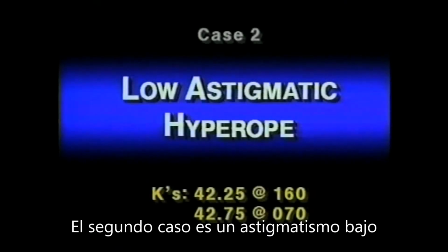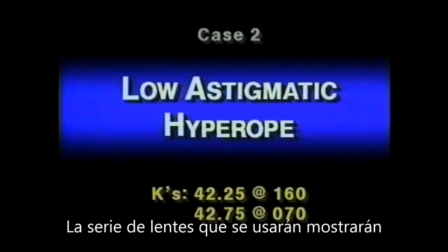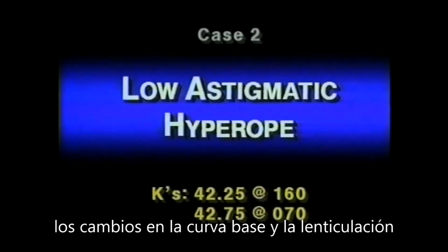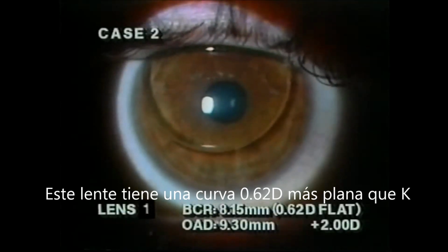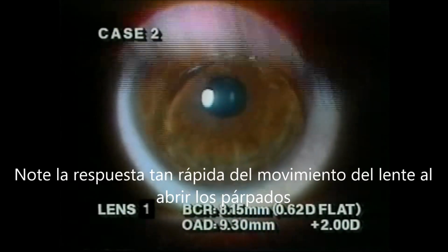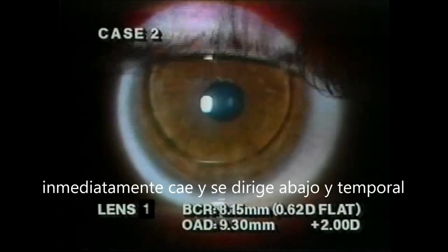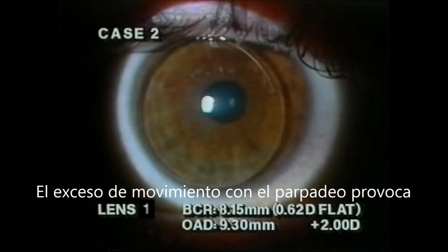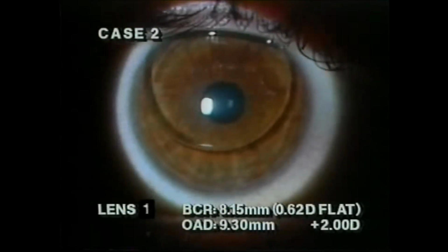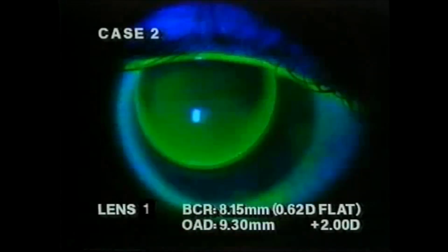Our second case is the low astigmatic hyperope. The series of lenses to follow show the effect of changing base curve radius and lenticulation. This lens is fit 0.62 diopters flatter than K. Notice how it is picked up by the upper lid and quickly drops or is bumped to an inferior temporal position. The excessive lens lag after the blink can result in variable vision, lens awareness, and corneal desiccation.